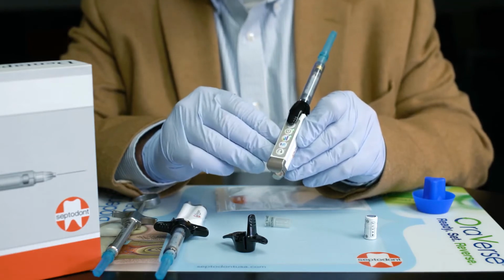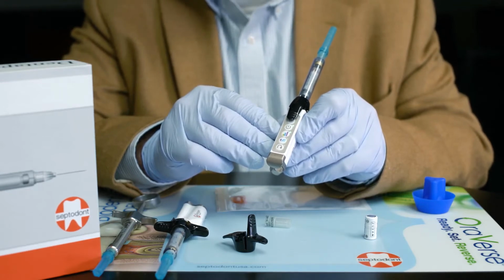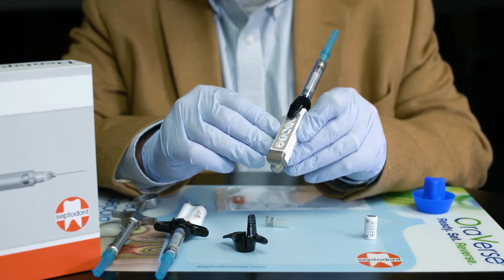The last is the green or slowest speed that delivers 1 ml in 90 seconds. You'd use that for the most painful injections like palatals and PDLs.